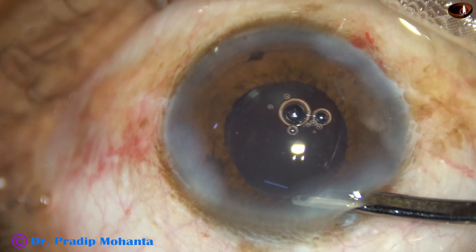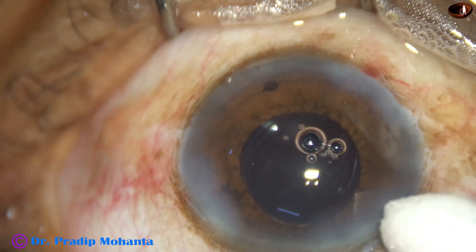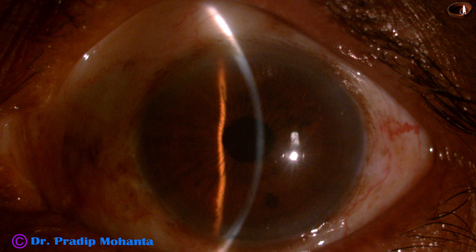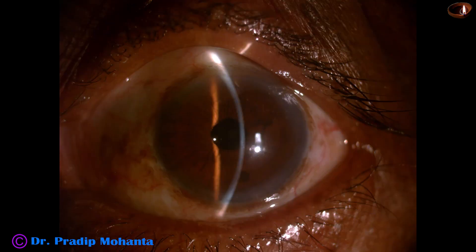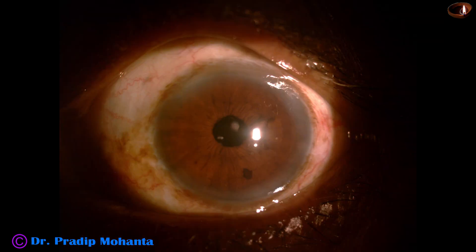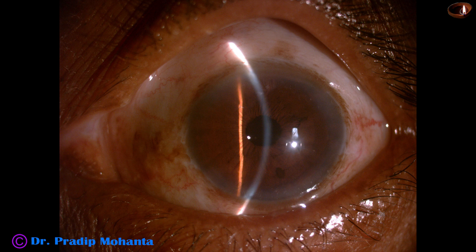This is the final formation of the anterior chamber. The intraocular lens is nicely centered, the pupil is round, and integrity of all wounds is checked. A few drops of moxifloxacin are applied over the ocular surface and the case is concluded. Post-op pictures taken 15 hours after surgery — started at 4 PM, pictures taken at 7 AM — show absolutely clear cornea with no edema, a quiet anterior chamber, round and central pupil, and visual acuity of 6/12 unaided. Patient is very happy, and I am also very happy having overcome several challenges in almost 40 minutes.